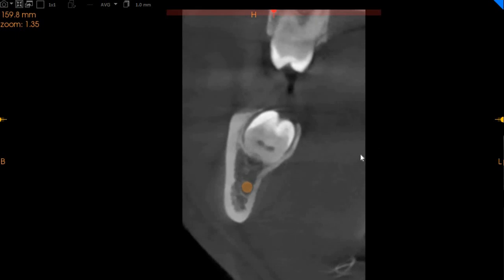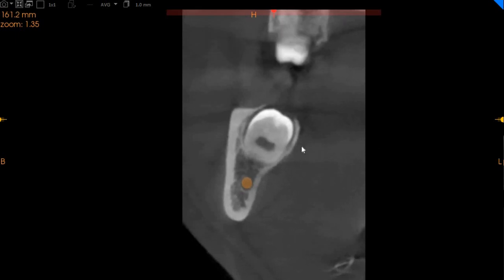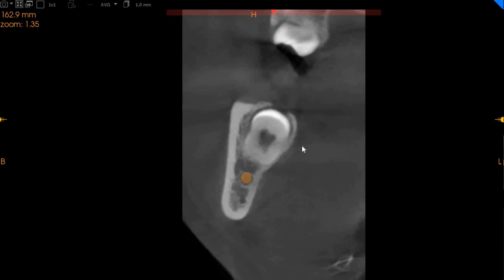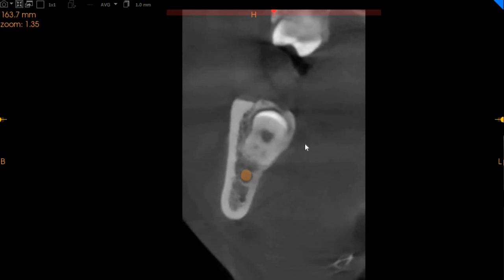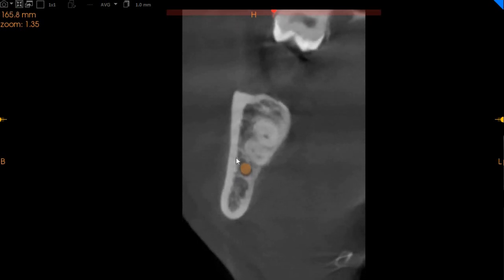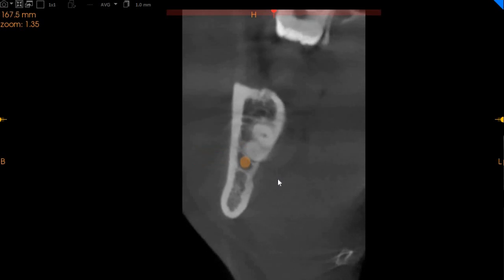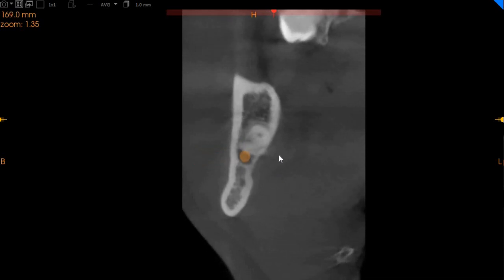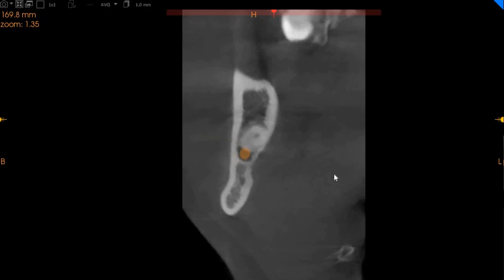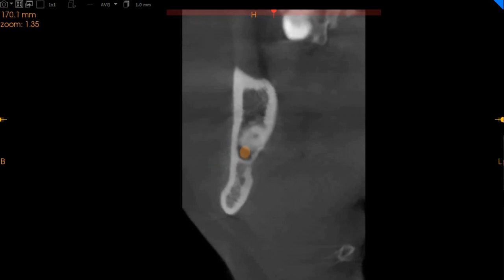Now this is the lower left wisdom tooth, as you can very clearly see. The lower left wisdom tooth is mesioangular impaction, and here also at mid root level the inferior alveolar nerve comes in very close contact with the mesial root of the lower left wisdom tooth. As we move further towards the apex, you can see that the lower left wisdom tooth is in fact actually compressing the inferior alveolar nerve on the lower left side. So the lower left is more in contact and more closely associated with the inferior alveolar nerve.